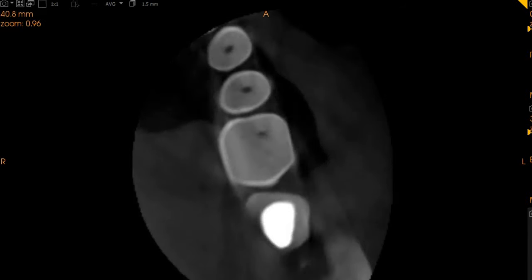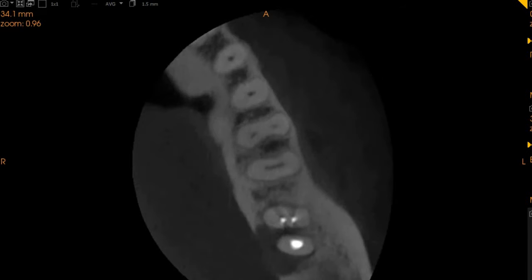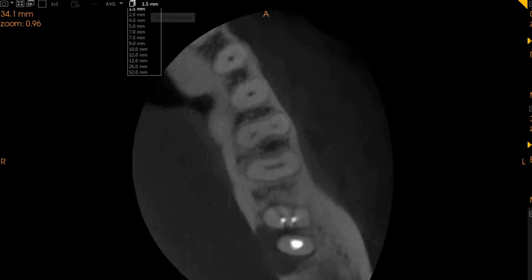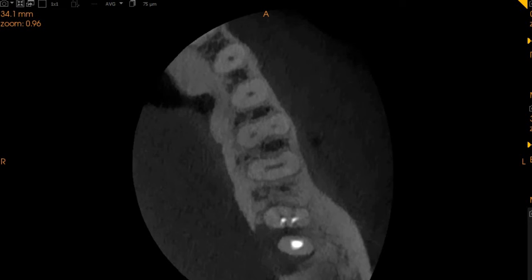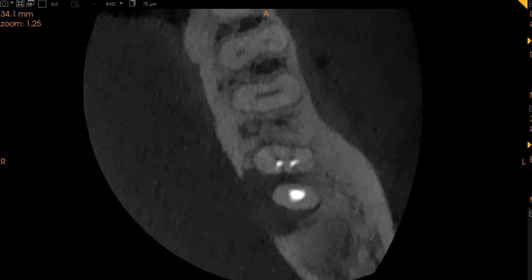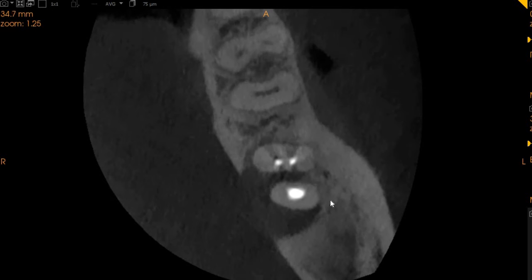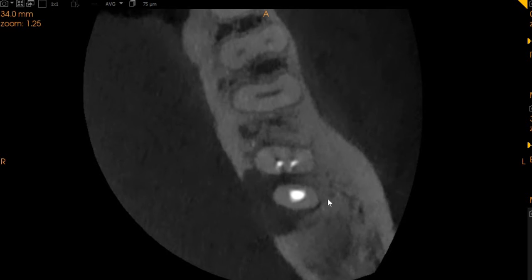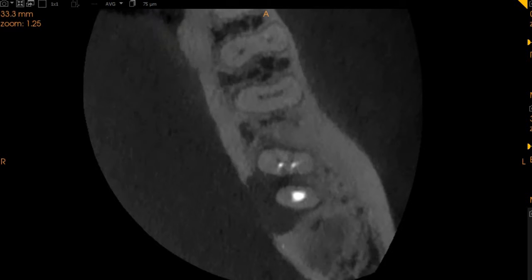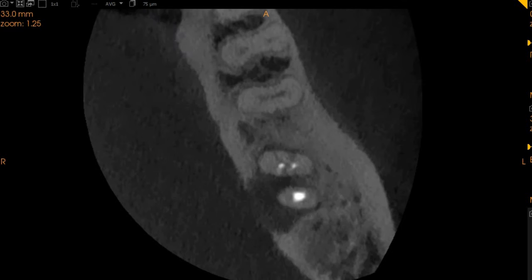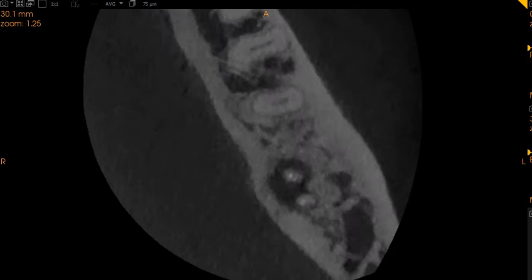This is the axial view — the top-to-bottom view. Here we will also be able to show you exactly what's going on. The mesial root also seems to have a slight crack situation. This is the lingual aspect, and this is the apex of the tooth, as you can see right here.